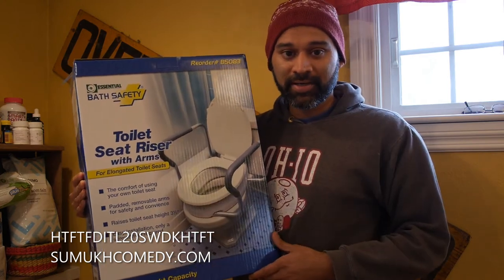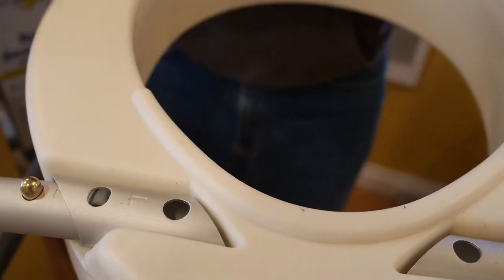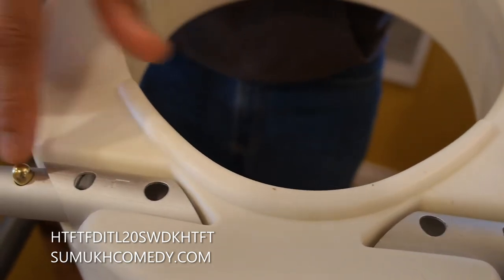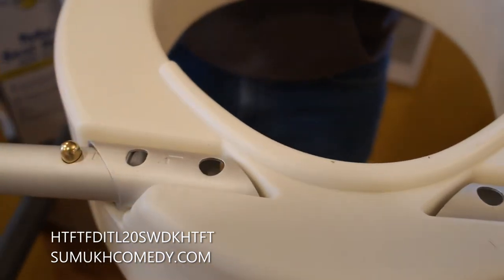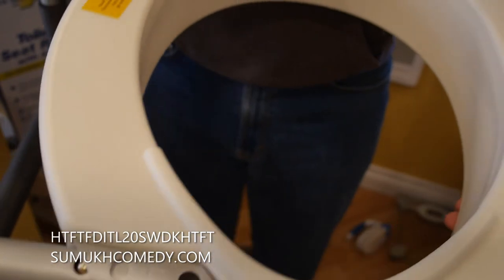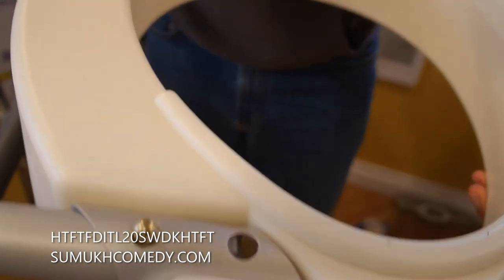Now that I feel like I'm Vanna White, let's go ahead and have me show you how to install a toilet seat riser. You'll notice that the riser has an indicator for each arm to tell you which arm it is and which side it should be connected to. Here's the L for the left side and then the left side arm, and you'll go ahead and just push those through to connect them.